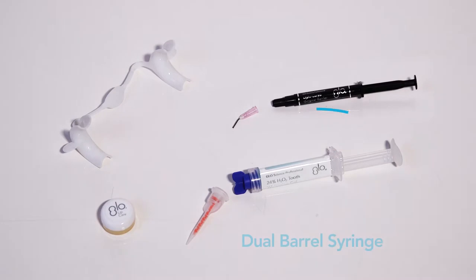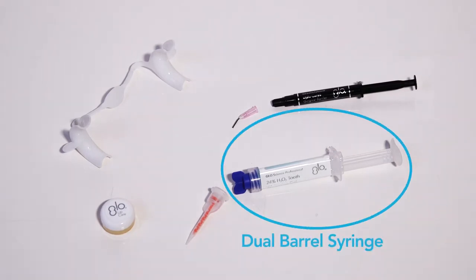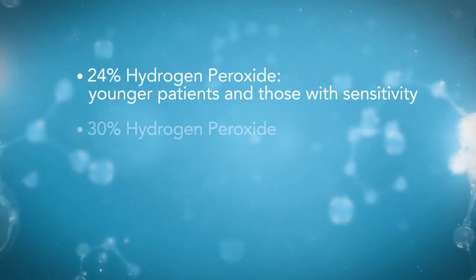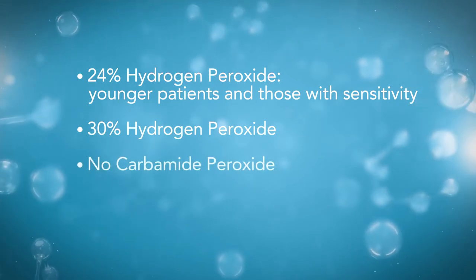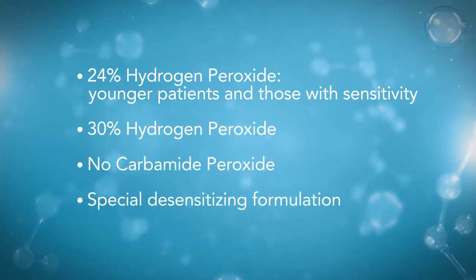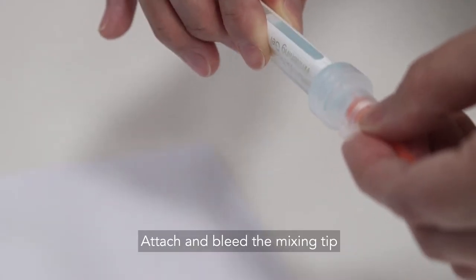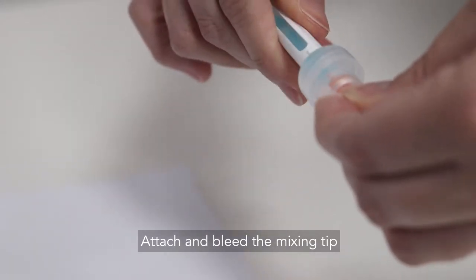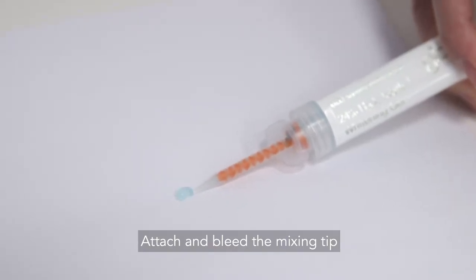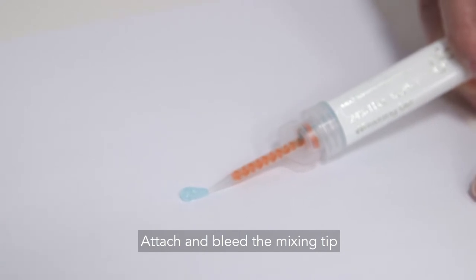The Glow Science whitening gel is applied using our dual barrel syringe. It is available in two strengths: 30% and 24% hydrogen peroxide. 24% is for younger patients and those prone to sensitivity. Unique to Glow, it does not contain any carbamide peroxide and is formulated with additional desensitizing ingredients. Attach the orange mixing tip to the syringe and bleed the tip to ensure even mixing of the two chambers and fully activated fresh gel.